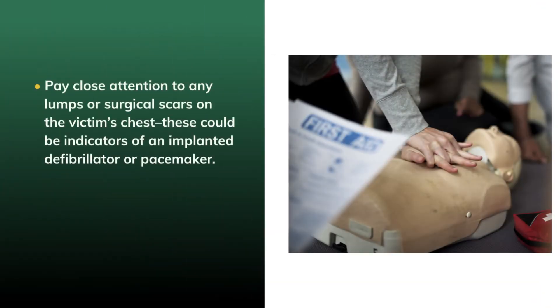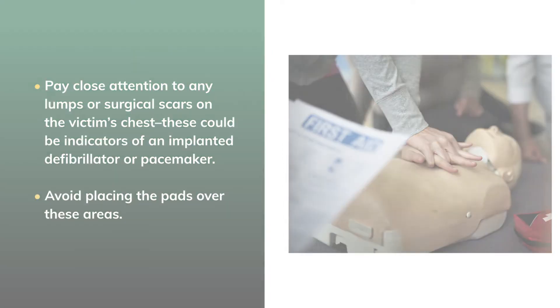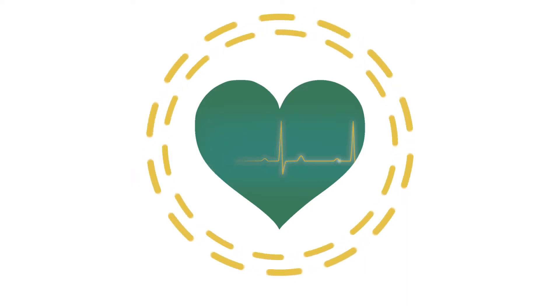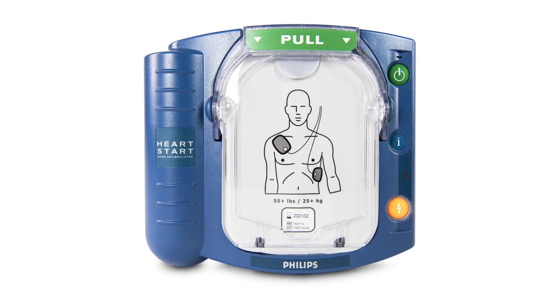Press the pads firmly into the skin so that they make good contact. Be sure to note any lumps or surgical scars on the victim's chest, as these could be indicators of an implanted defibrillator or pacemaker — avoid placing the pads over these areas. The HeartStart Home AED will start analyzing the victim's heart rhythm after the pads are attached, and the device's caution light will begin flashing. Nobody should be touching the victim during this time.